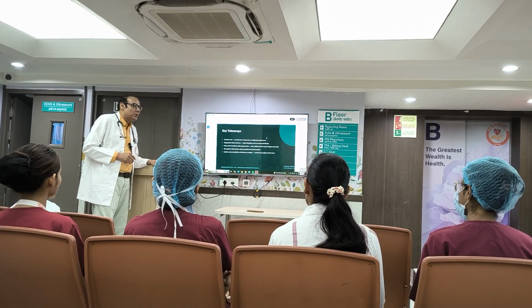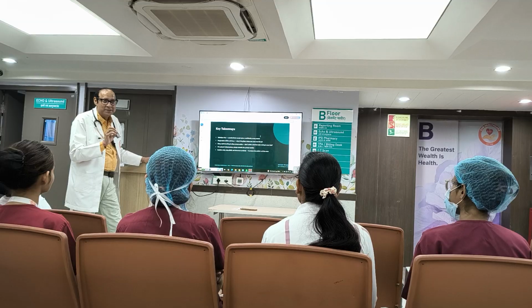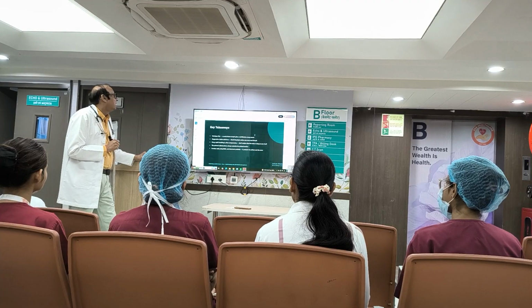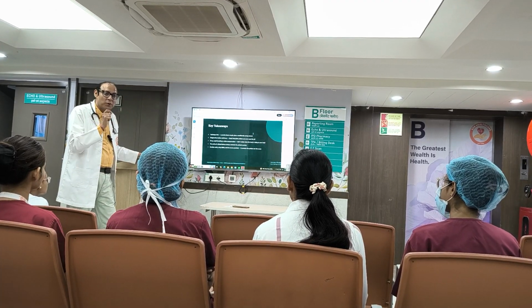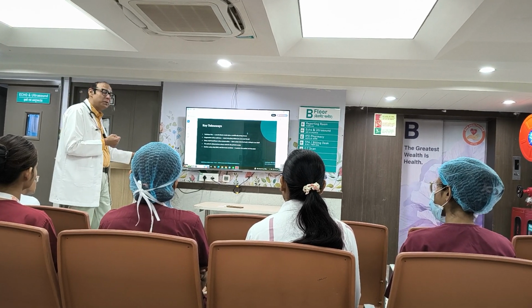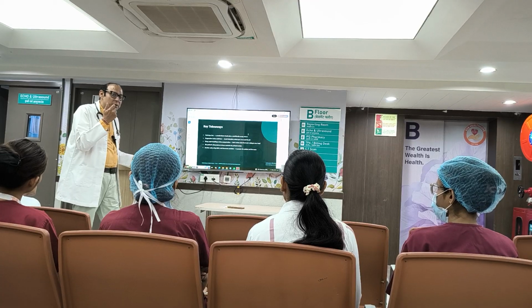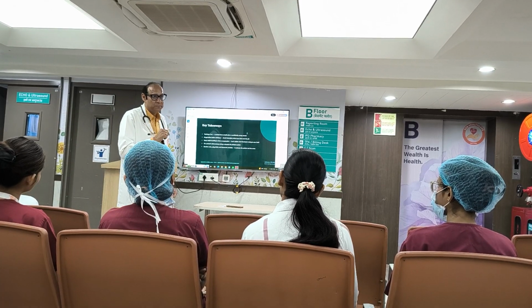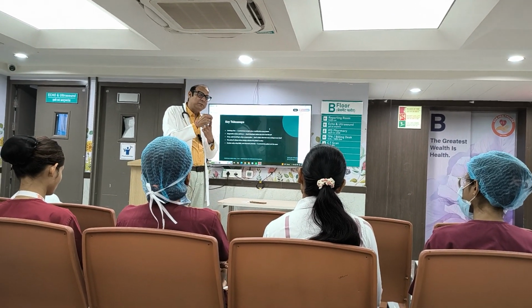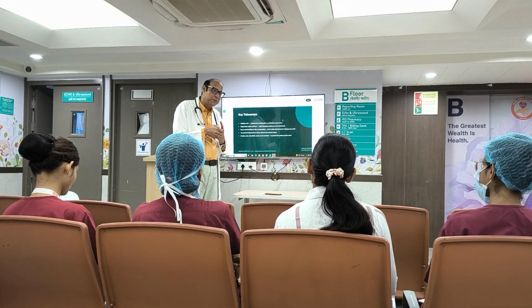The key takeaway is very important. One key takeaway you must not forget, always remember this, tie it down firmly: technique first, how to take the sample. If the technique is wrong, you will get a contaminated sample with errors. So be careful while taking the ABG sample and VBG sample. If the doctor wants to see the metabolic component, better go for VBG. What is the difference between ABG and VBG? ABG we see for oxygenation. VBG we see for the metabolic component, like DKA and other metabolic conditions.